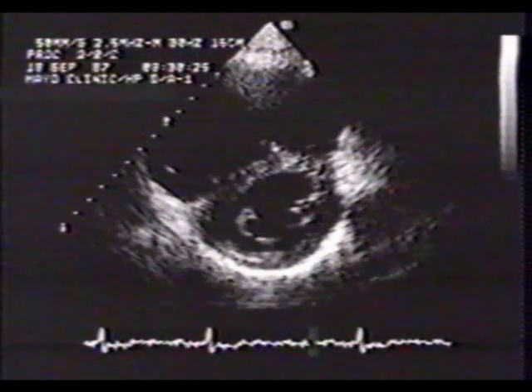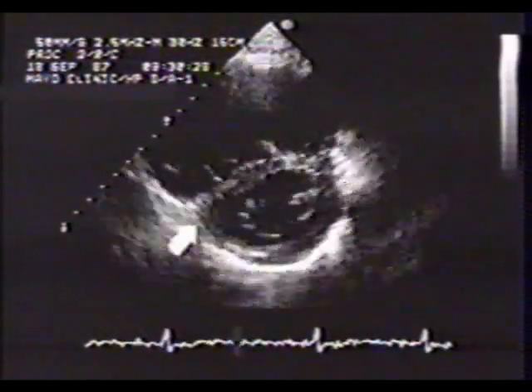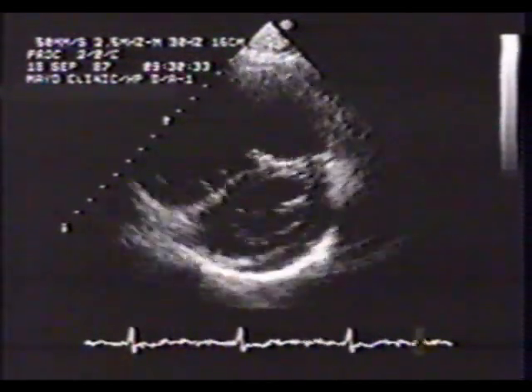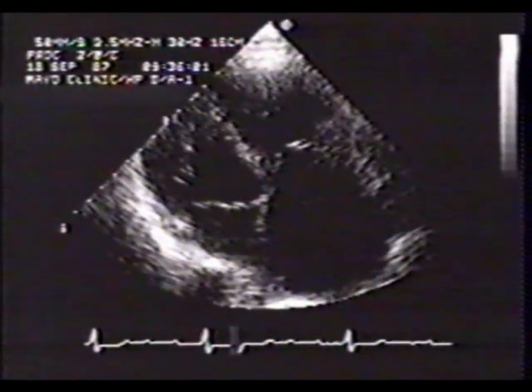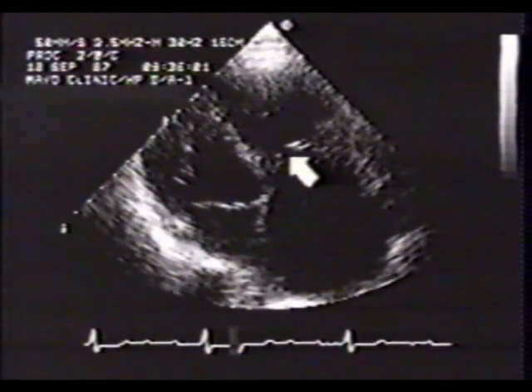In parasternal short axis, marked right ventricular enlargement is apparent. There is thinning of the inferior wall and inferior septum. In real time, these segments are akinetic. This apical four-chamber view is modified to focus on the huge right ventricle and right atrium. Because of marked RV enlargement and dilatation of the tricuspid annulus, the tricuspid leaflets do not coapt in systole.